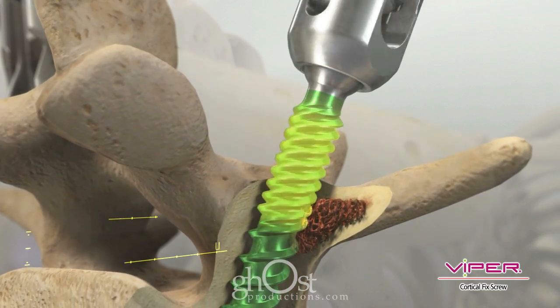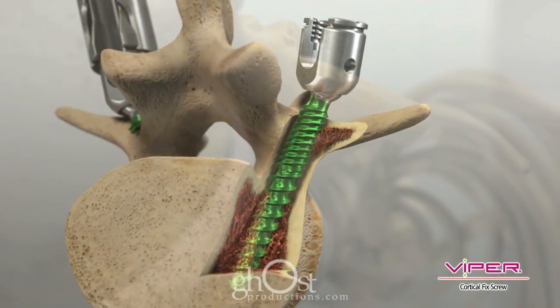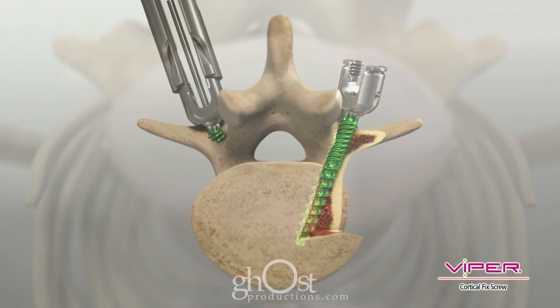The dual to quad lead thread form is designed to seamlessly integrate with both the cancellous and cortical bone of the vertebral body and pedicle.